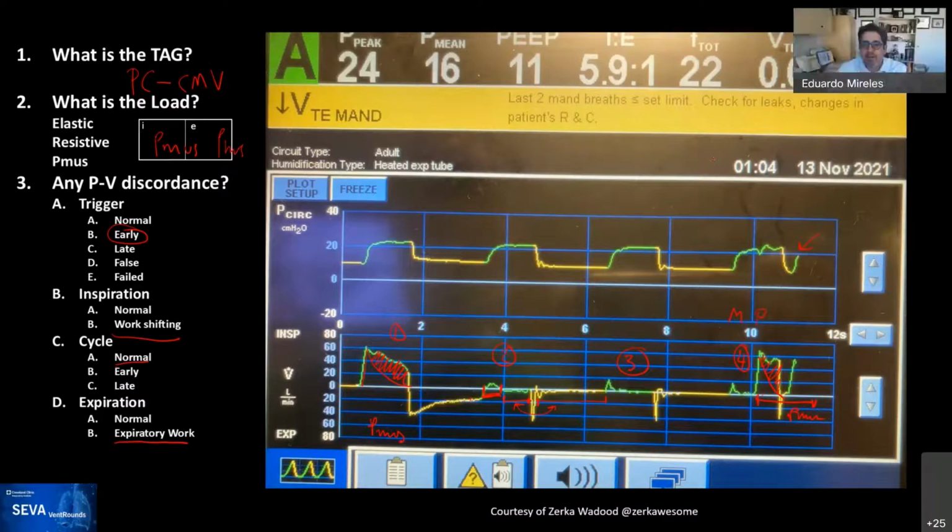Yeah, I remember now. Actually, that's perfect, Rob. So you see the ventilator displays tidal volume exhaled. Yep. And it counts exhaled from here to here. And so if you exhaled here, the VTE would be smaller than the VTI, the actual volume that the patient got, because he exhaled over here. And so when you're at the bedside, you will only see this volume and you would say, oh, the patient is perfect. And maybe he's getting more, but he's exhaling during inspiration. Exactly.